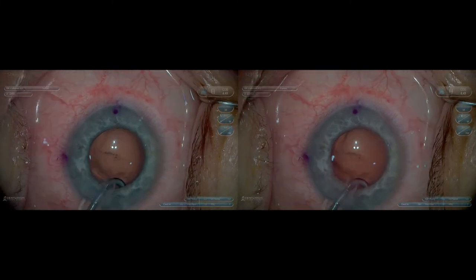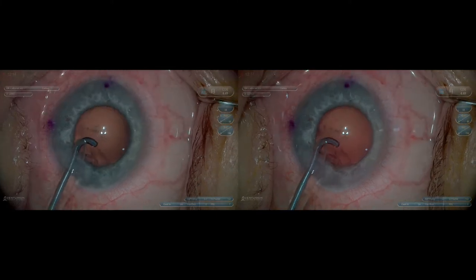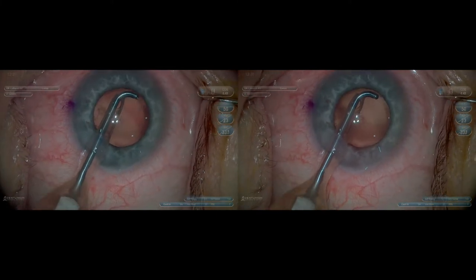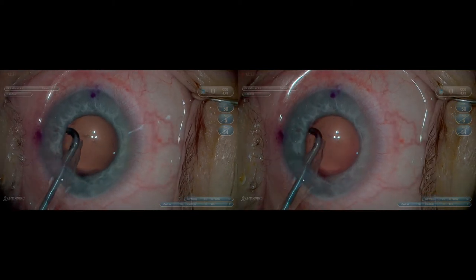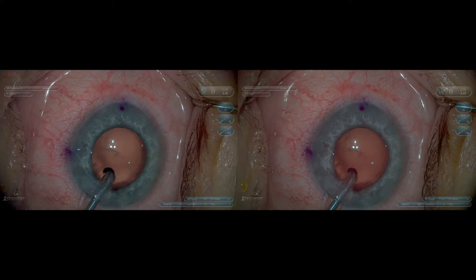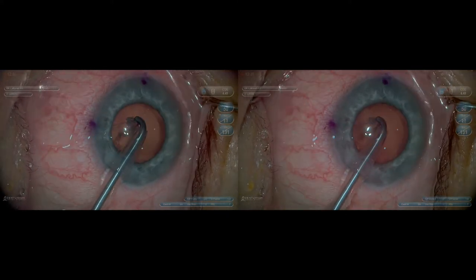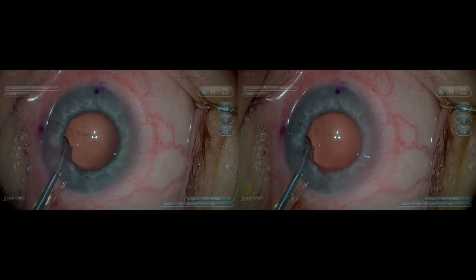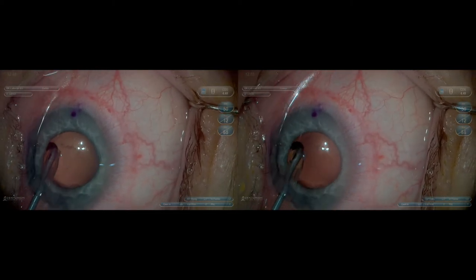I sped up this segment to keep the video moving along. This is a 90-degree tool I use for sub-incisional removal. Notice that I did not have to zoom in or adjust focus during the entire case because of the extended depth of focus provided.